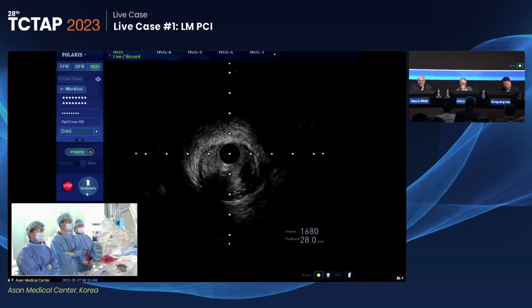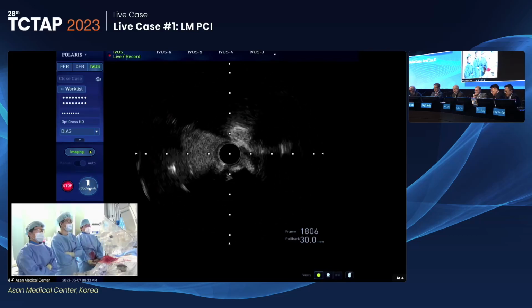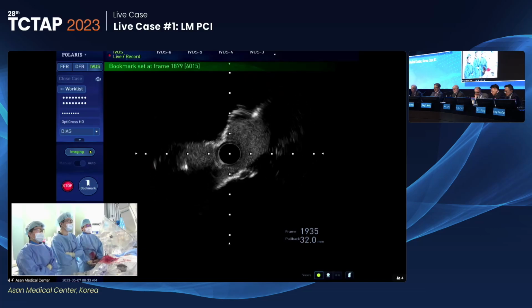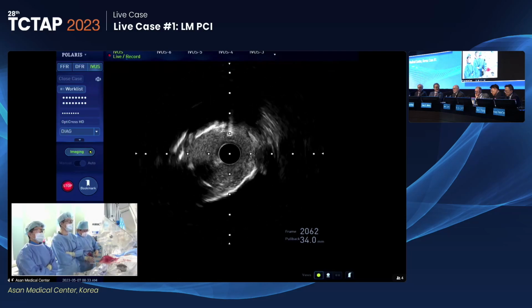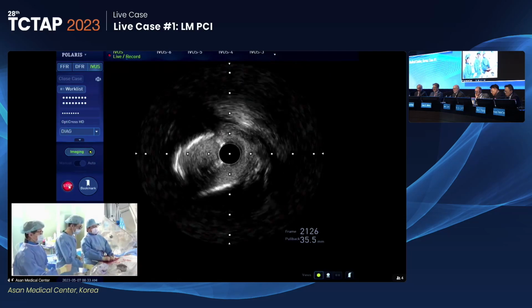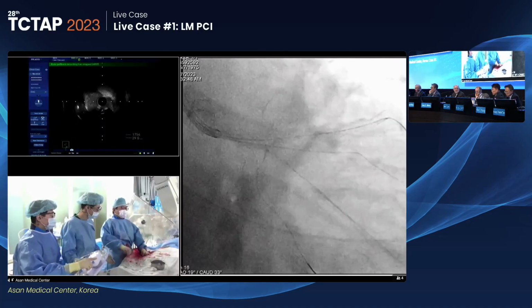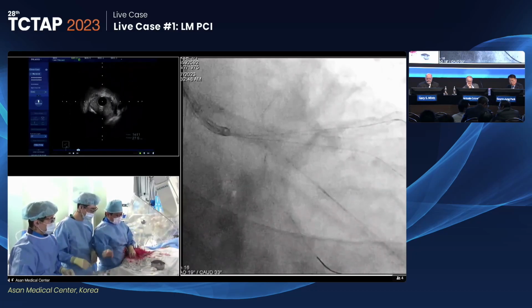I'm just going to ask, does he have renal insufficiency at all? No, kidney function is very nice. Not yet. Because you're looking at somebody who's 48 with this degree of calcific atherosclerosis, you sort of wonder why. I think Alan's point is well taken, but there are other things that could be contributory. For all high pressure balloon.